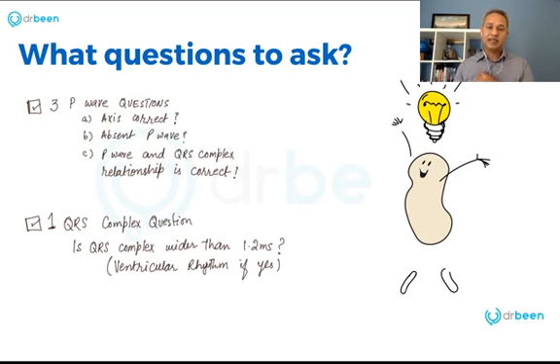Now, if for some reason there is a problem that the SA node is not working, that is what arrhythmia is, right? SA node is not getting a chance to do some ectopic thing, or some reentrant mechanism is working. What do you think will happen to the P wave? It really depends. So look, if the impulse starts from here and impulse travels downwards and P wave is upward in lead 2, then if impulse travels upward, then the P wave will become inverted in lead 2. So one important thing to keep in mind, P wave's axis will become disturbed with the arrhythmia which are of ectopic in origin.